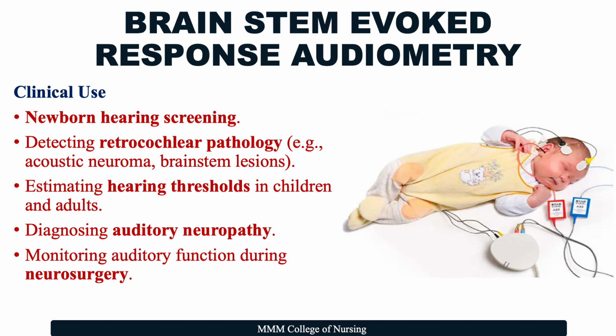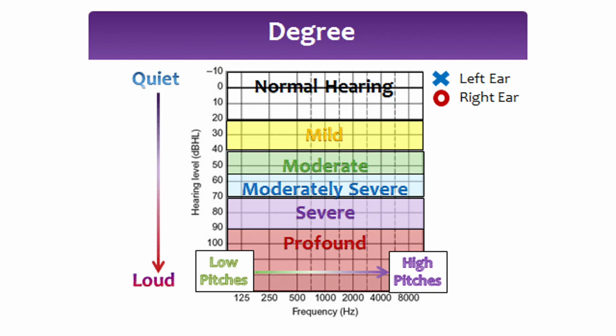Let's look at the clinical use. It is used in newborn hearing screening, detecting retrocochlear pathology in cases such as acoustic neuroma and brainstem lesions, estimating the hearing thresholds in children and adults, diagnosing auditory neuropathy, and monitoring auditory function during neurosurgery.